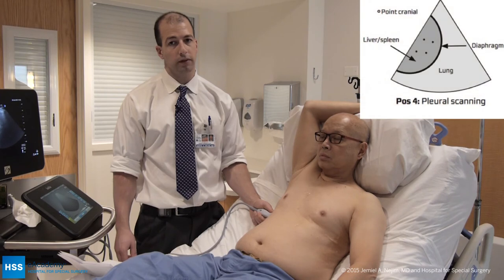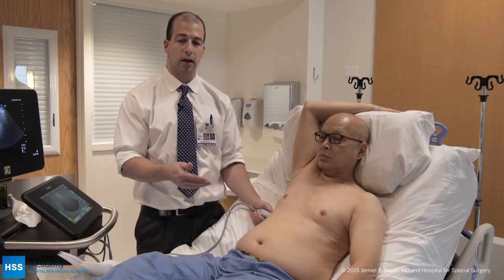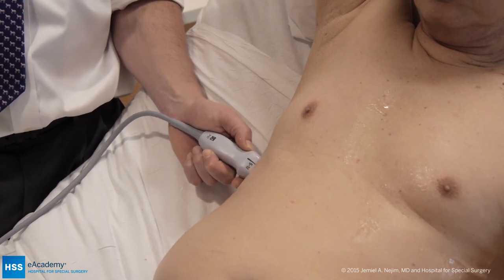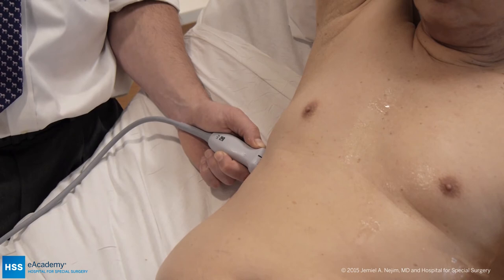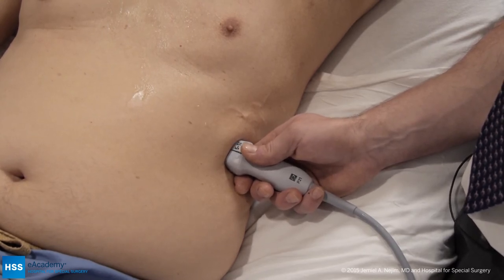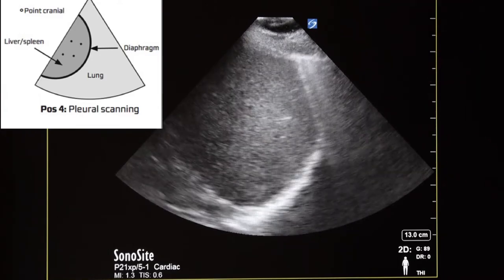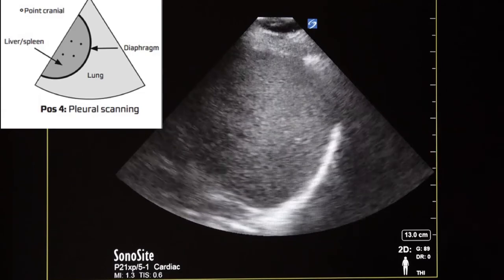The last view is our pleural view, which we look at from both the right and left sides. The patient is positioned sitting up, which allows us to evaluate for pleural effusions as they pool on either side. For the right-sided pleural view, we hold the probe with the orientation marker towards the right shoulder, positioned in the mid-axillary line, looking for an image that transects the liver. In this view, the liver is here, the pleura and diaphragm are visible, and the lung field is on the far right of the screen.